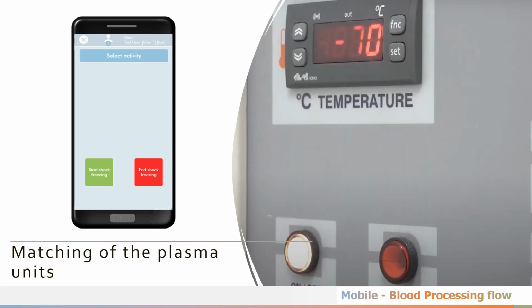The same traceability for single action will also be made for the breakdown of the plasma units. Again, in this case, the most suitable devices can be used for the registration of the units. Whether it is mobile or PDA, the SCWeb system can be integrated to all management software systems and will not repeat what has already been registered. It will integrate the information when the system is not in control of the information traced.